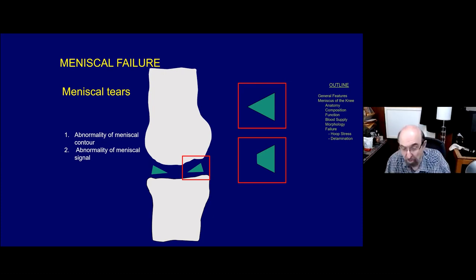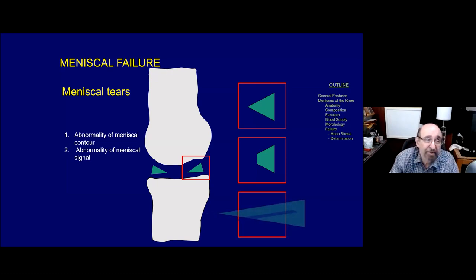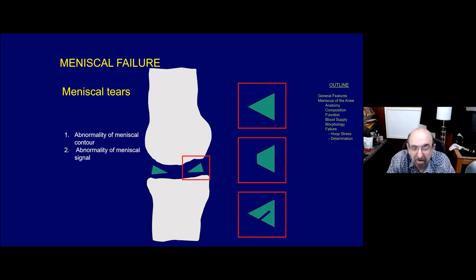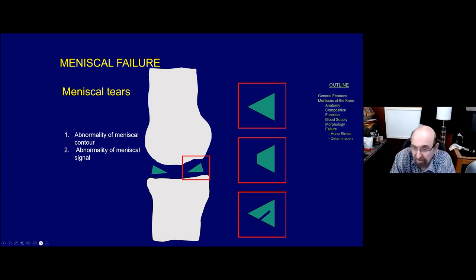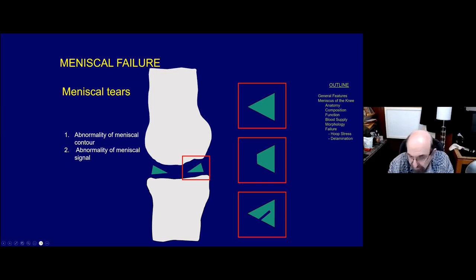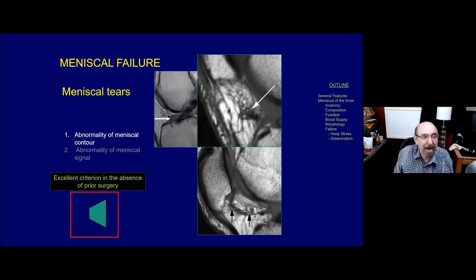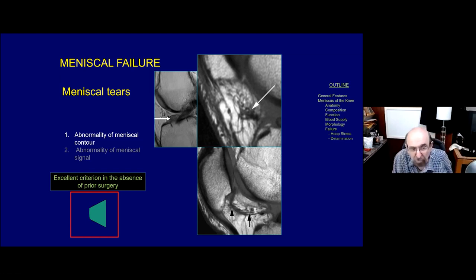The second criteria is an abnormality of meniscal signal. The classic teaching is that if you have altered signal - gray or even bright fluid - that violates the top, the bottom, or the apex of the meniscus, it's evidence of meniscal tear. The periphery of the meniscus does not count as a meniscal surface. The first criterion, an abnormality of meniscal contour, is simply terrific - if you can eliminate the possibility of prior surgery.